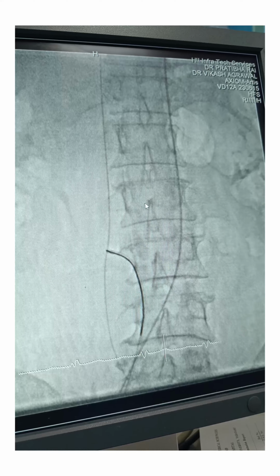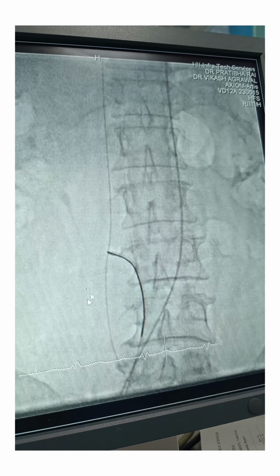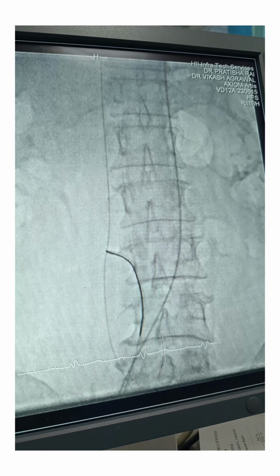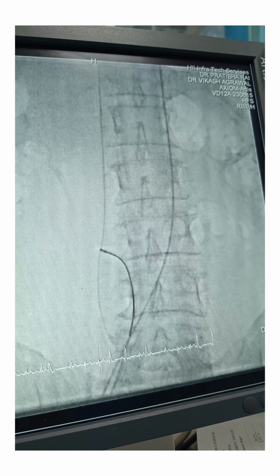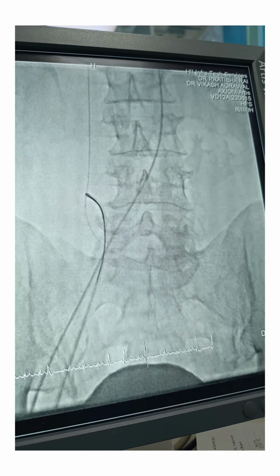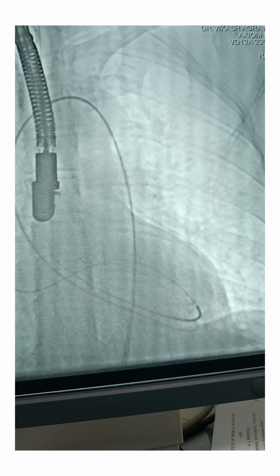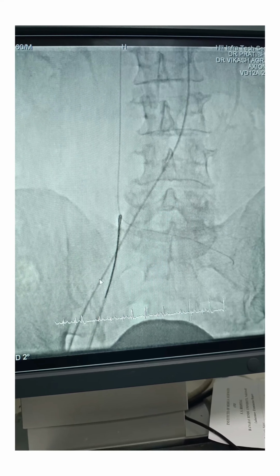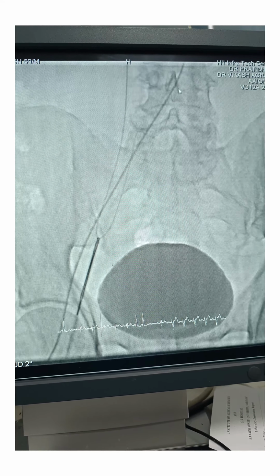So next step is this, I am snaring the wire from LPA across the IVC to our right femoral vein. I wanted to make an arteriovenous loop, but while making I realized, I'll show you next frame. I'm snaring. But no, again you tell us the path of the wire. So this is the femoral artery. My catheter is going across the arch into LV.